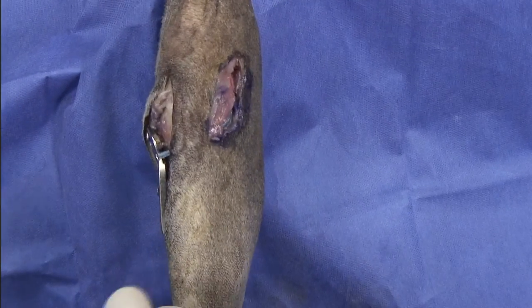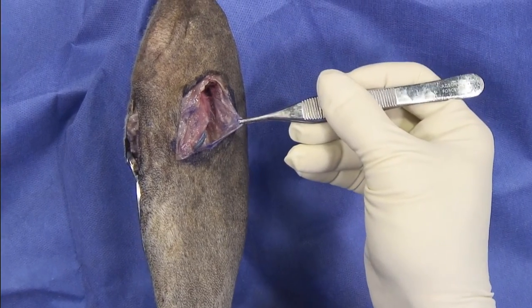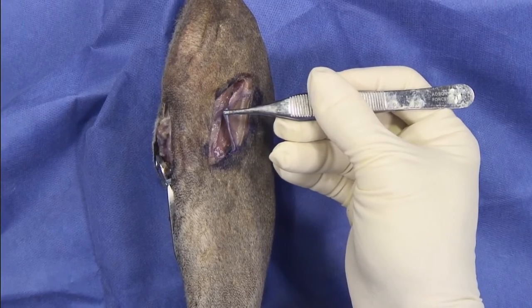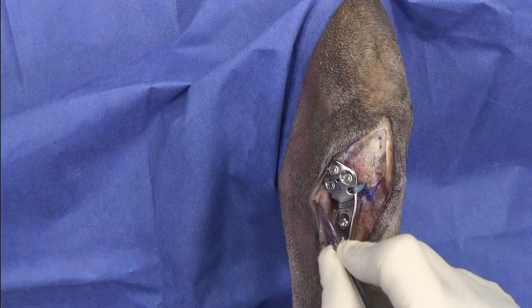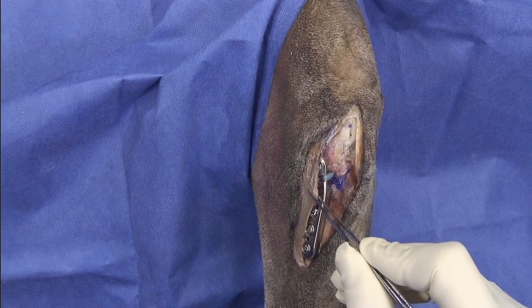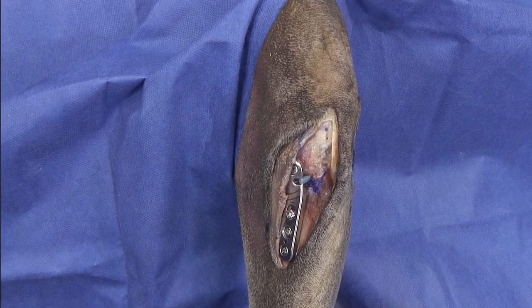The closure is done as a standard closure following an extracapsular technique, with a lateral imbrication. The closure here is done by bringing the fascia on top of the plate and closing the fascia on the cranial aspect of where we removed it from.